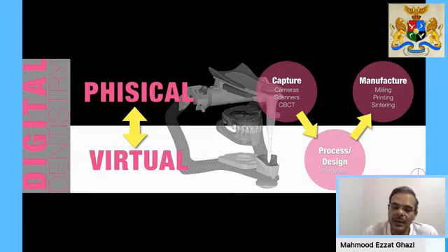And we do this using digital smile design. I'll give a quick overview about this. So we use cameras where we take photos of our patients, and we do our smile design accordingly. We use intraoral scanners or lab scanners where we scan our models, or we scan our patients intraorally, where we can see the teeth and the gums. Now we have a 3D overview of the teeth and the gums. And then we do our CBCTs, where we now have an overview of the bone and the roots. So there's no information missing there. You have the face, you have the teeth, the gums, and you have the bone and the roots. All the information needed is all in one place, and this is where we capture all the information.